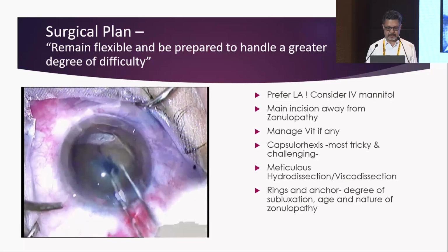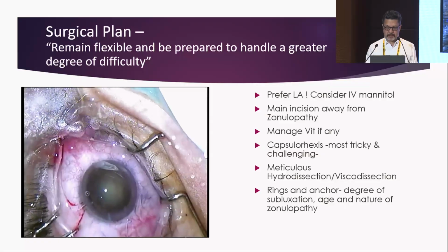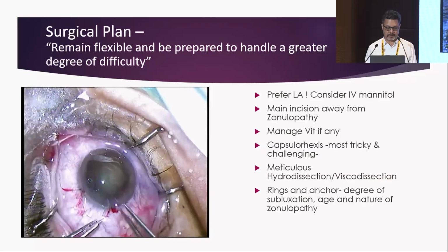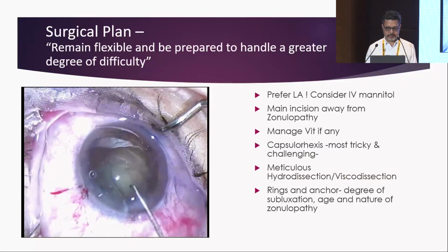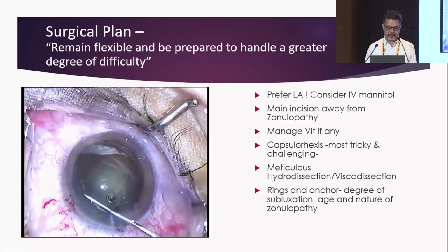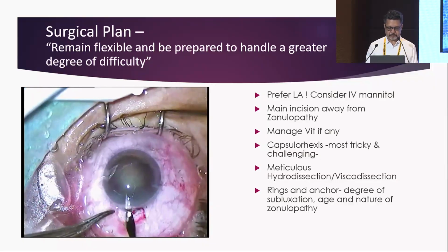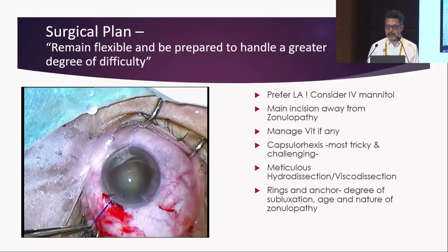Here I plan to use the Gupta capsular segment. I don't have any financial disclosure; we work in a low resource setting. We don't have access to the other segments. So here we are using the Gupta segment. So you can fixate your bag with the Gupta capsular segment. And we have made a capsular flap for engaging with the iris hook.